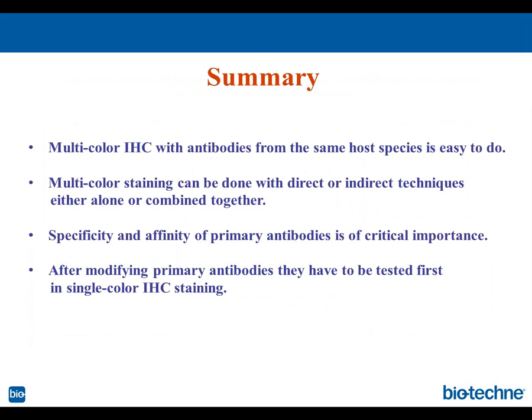Another question here was to do with the adding of the antibodies. So do we mix together the primary antibodies in one cocktail, and also do you incubate the secondary antibodies together? We mix them together. I assume the question is about when we do the staining with the antibodies in the same host species. We do combine only primary antibodies which were modified. We do not combine unmodified and modified. Modified, I mean primary antibodies conjugated to haptens. That's why we do them in separate steps. But we can combine them together and we can use them as a mixture. So the answer is yes.